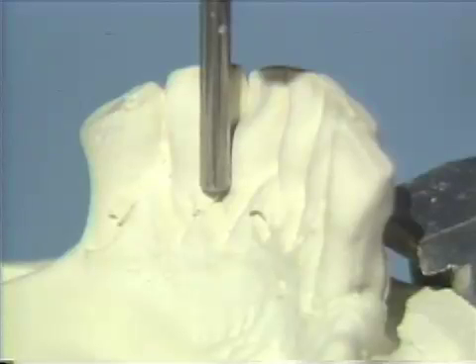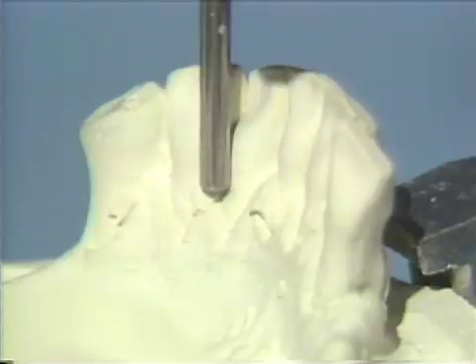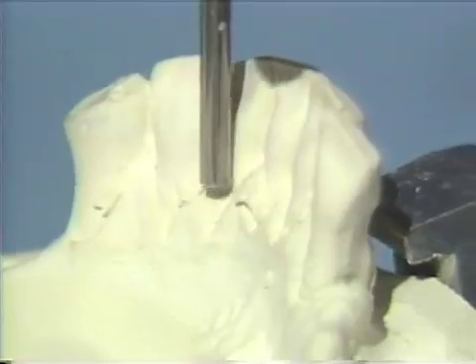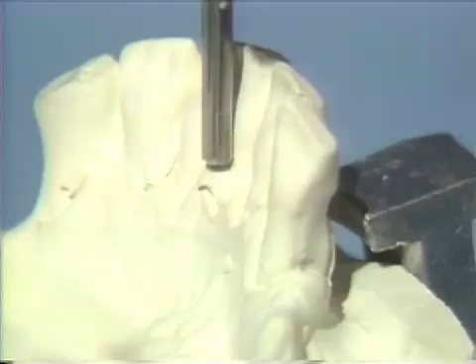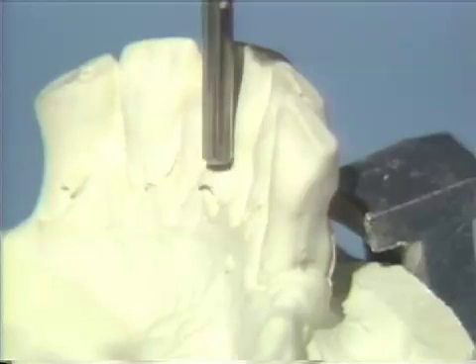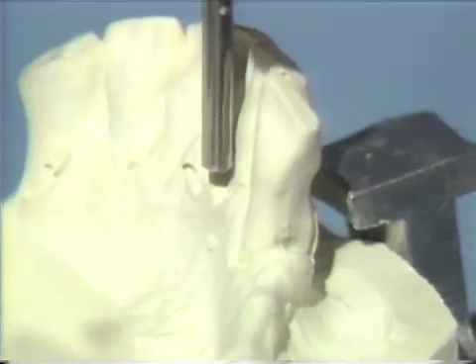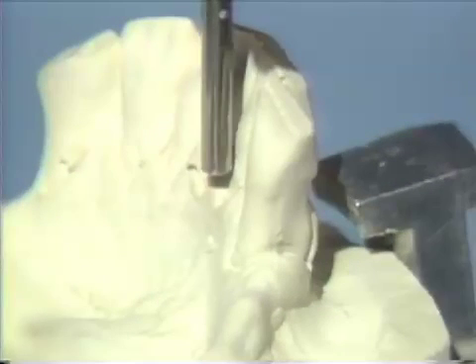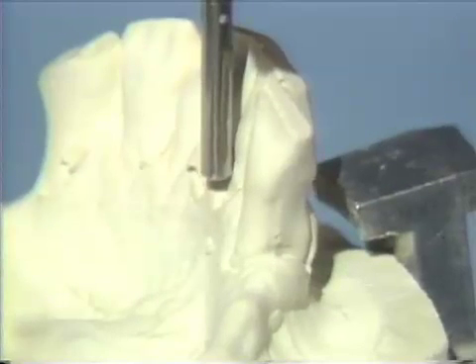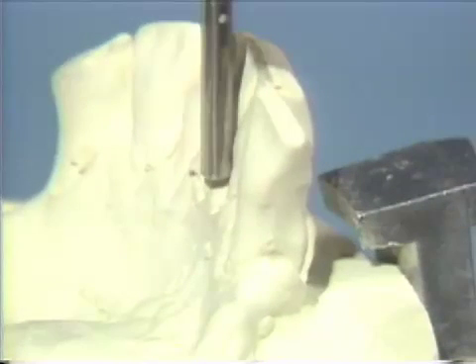The linguals of teeth 23, 24, and 25 have no suitable occlusal rests and have short lingual guide planes, especially the primary abutment tooth number 25. All three teeth will be treated together by placing raised cingulum rests and lingual guide planes to gain support from all three teeth.